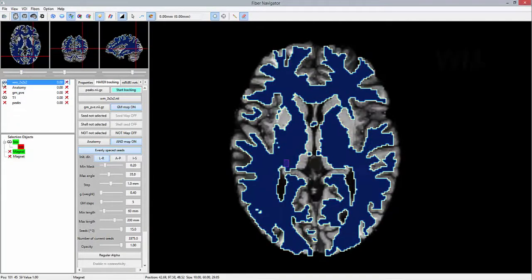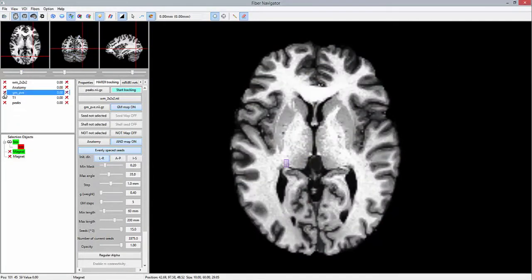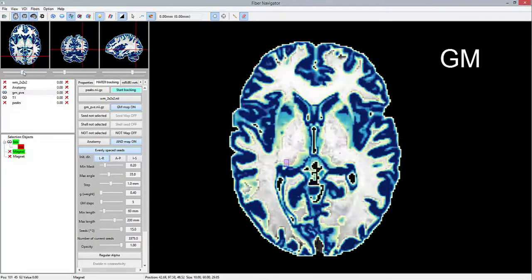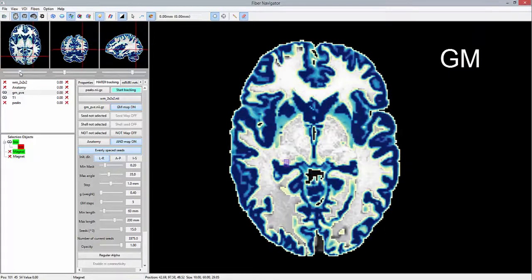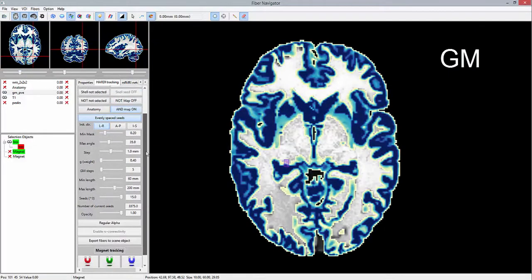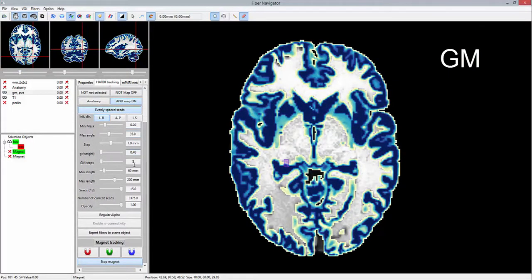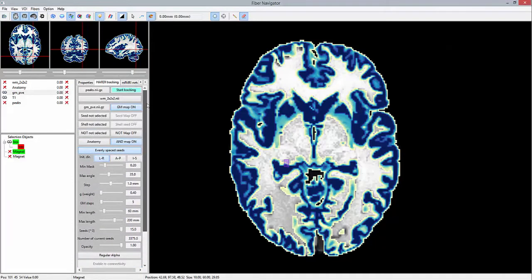Our tracking domain consists of a white matter mask. A gray matter mask will serve as a termination mask, allowing a maximum of five consecutive steps in it.